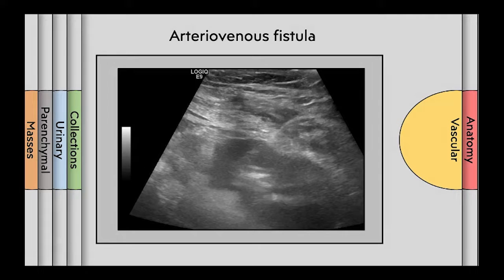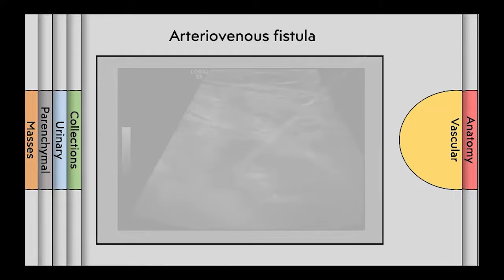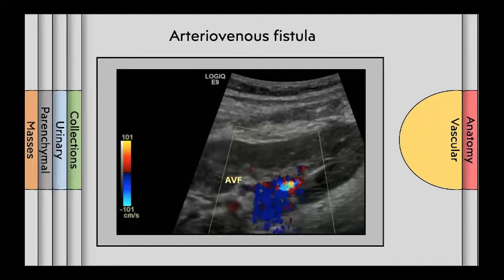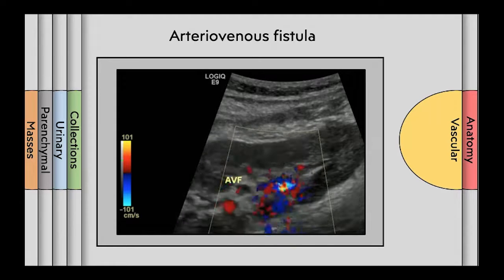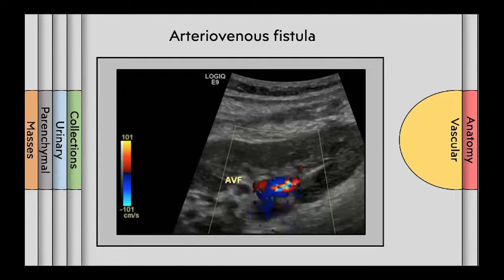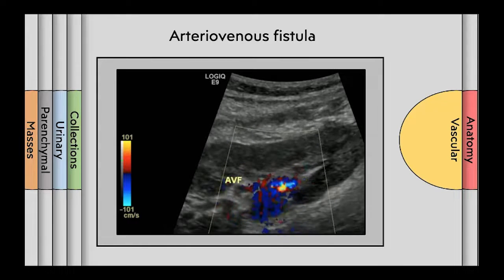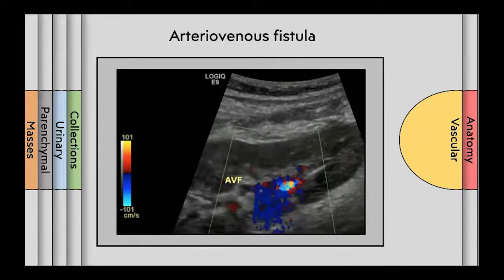Here we can see a biopsy needle which was aimed too centrally towards the larger arteries and veins. After biopsy, an ultrasound was performed which demonstrates a flashing of Doppler signal, indicating turbulence from soft tissue vibration, also known as the sonographic bruit.